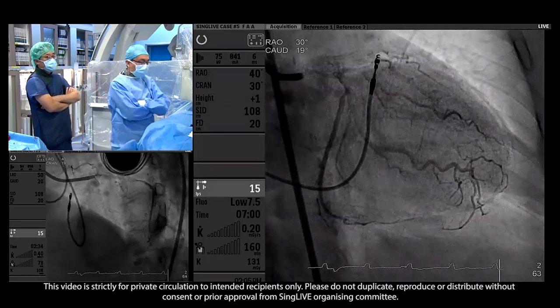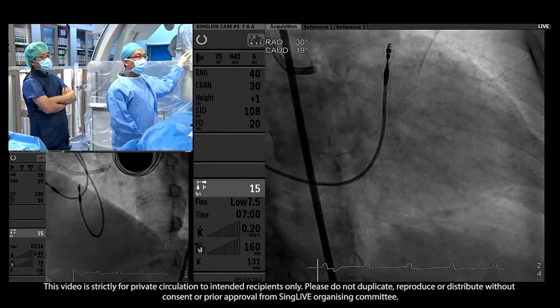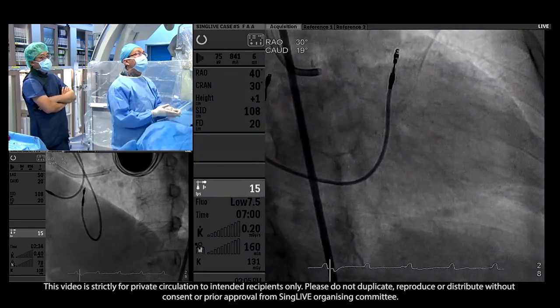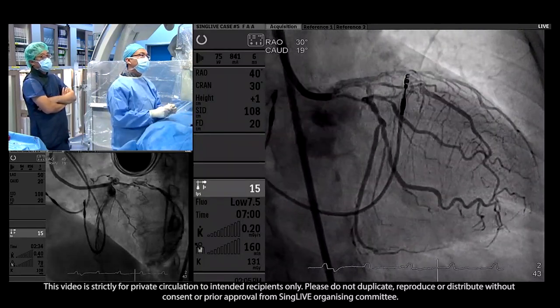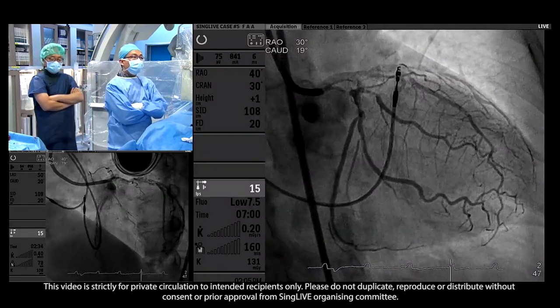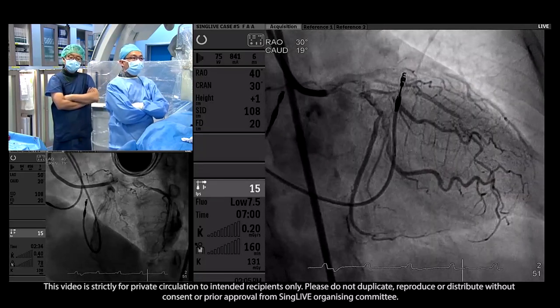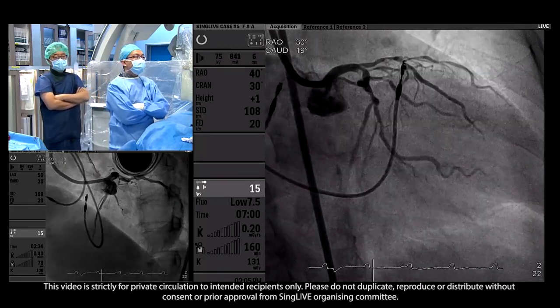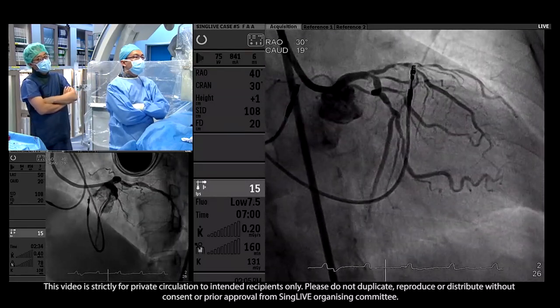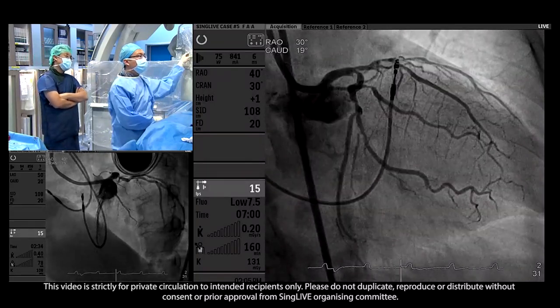Maybe some form of PCPS could be necessary, but with an LVEF of 35, maybe we don't need hemodynamic support, maybe just IABP. But my point is that, like everybody has discussed, this is a complex-looking angiogram. Is anyone thinking about doing an FFR in the circumflex? Because sometimes with these circumflex lesions, however difficult or ugly they may look, the FFR number is actually within normal range.